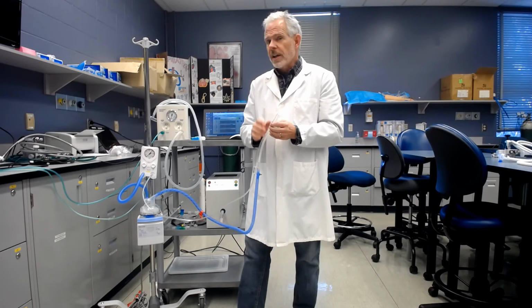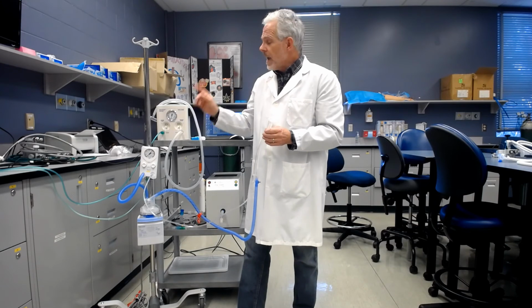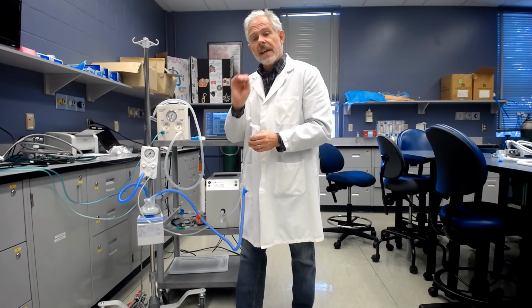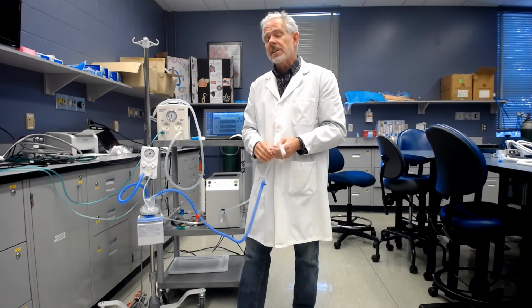And I know traditionally in the neonatal intensive care unit and resuscitation units, we haven't been using humidity with the resuscitators, but I think the rPAP does introduce the fact that it could be easily converted to do that, and that might be clinically significant.